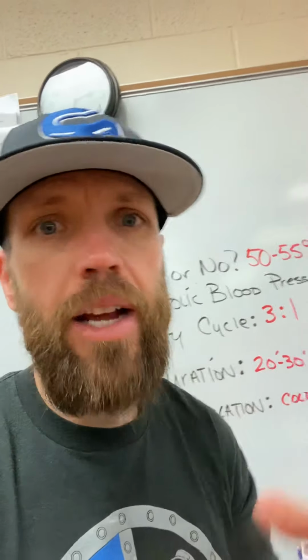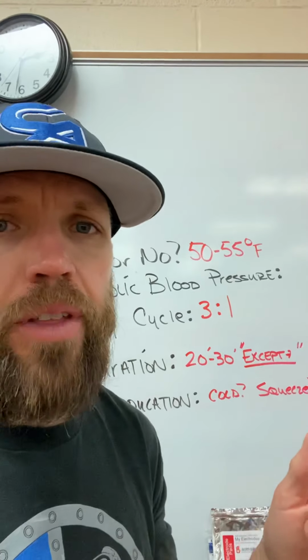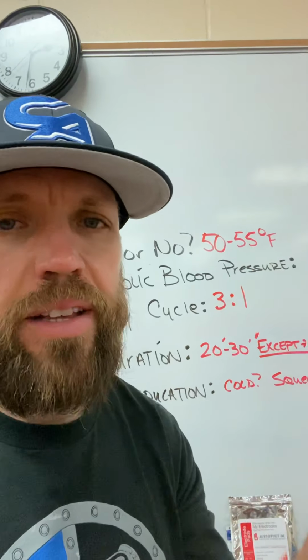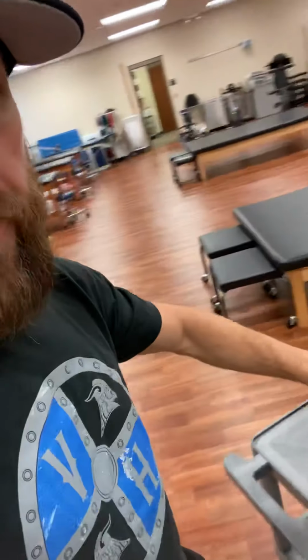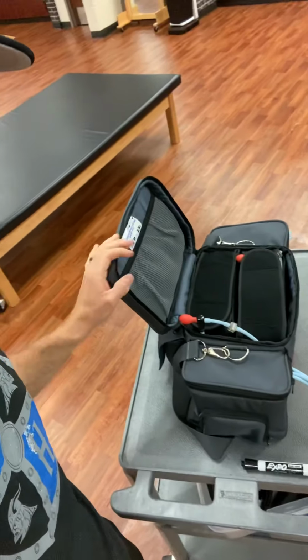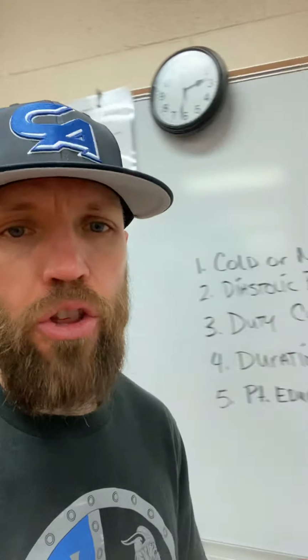But when you bring in that compression, that dude's squeezing, so it's going to get really cold. If you do that, our machine auto selects it, and because it has a very specific volume level for that ice and water to go in right there, and this is one of our tubes right here that it goes in, it's only going to allow a 50 to a 55 degree max. So that's already done for us. But that's optimal for bringing cold into compression.